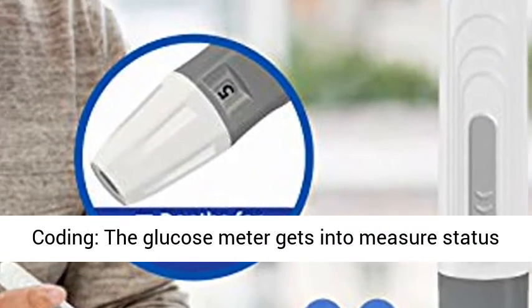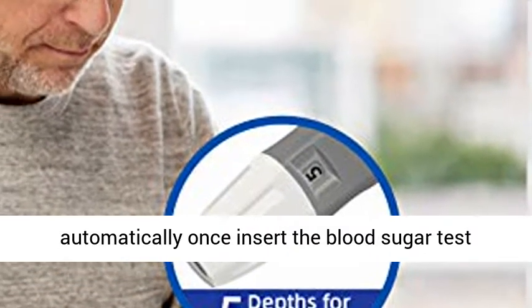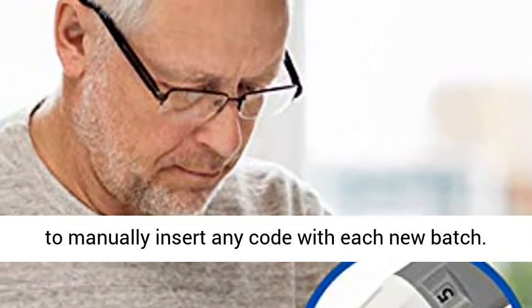No coding: the glucose meter enters measure status automatically once you insert the blood sugar test strip to the bottom of the slot, so you don't need to manually enter any code with each new batch.